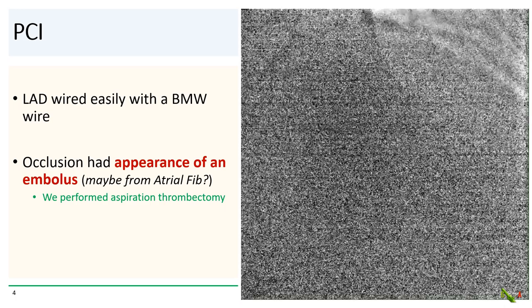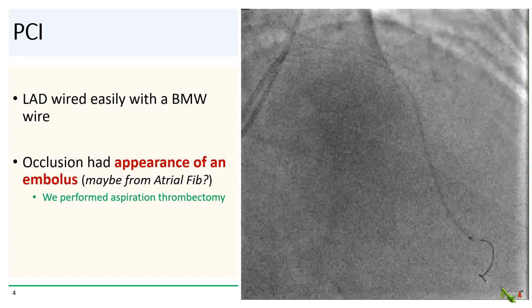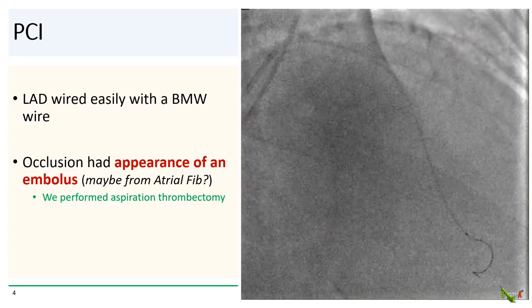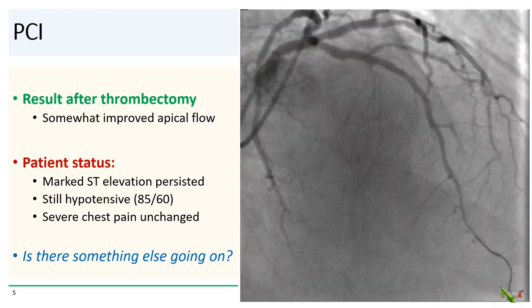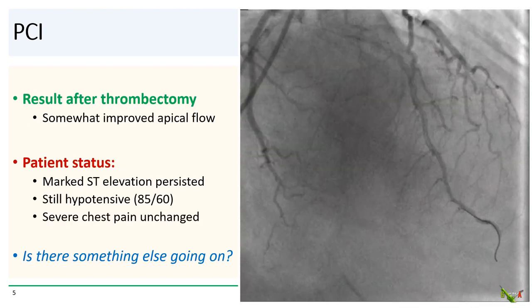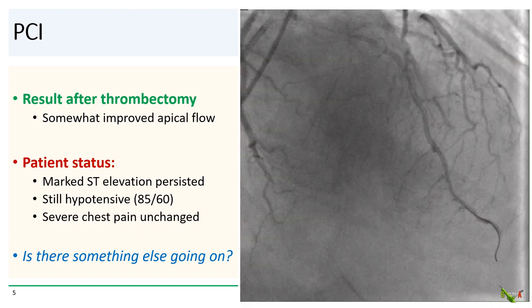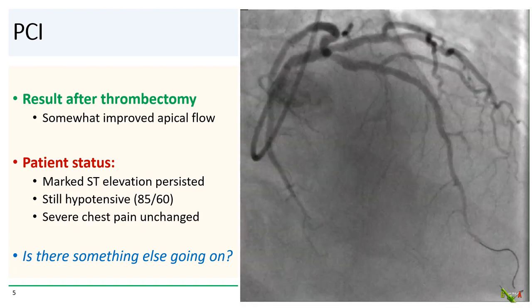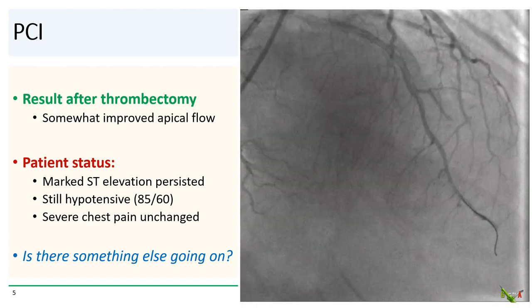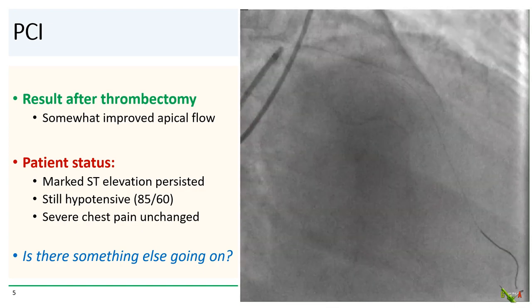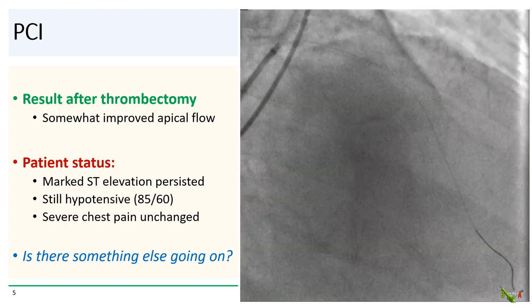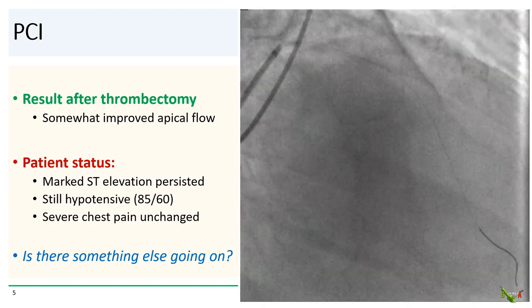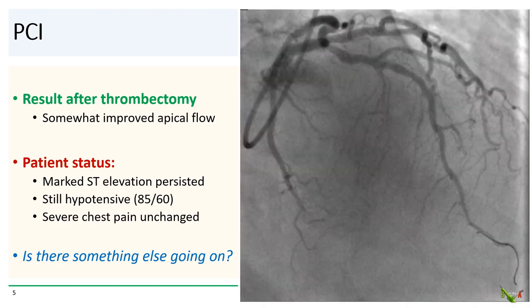So we went to work. The LAD was easily wired with a BMW. The occlusion was very distal and had the appearance of an embolus — we thought maybe from his paroxysmal afib. So we went ahead and performed aspiration thrombectomy, hoping not to have to place a stent so far distally. After aspiration thrombectomy, there was somewhat improved apical flow, but the patient still was not doing well.